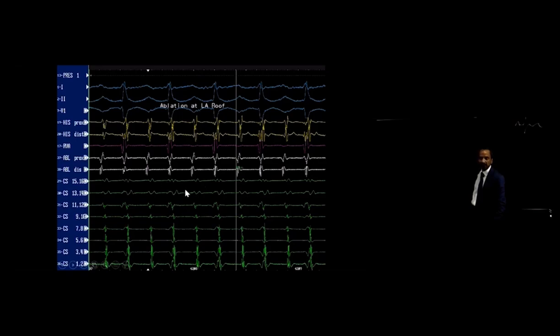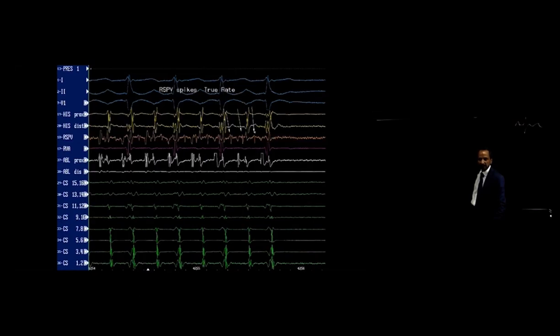Much like we think about paroxysmal atrial fibrillation, this patient, when mapping a variety of activation sequences, had very high frequency activation in the right upper pulmonary vein. So the patient was just like paroxysmal AFib, but presented as stable flutters.